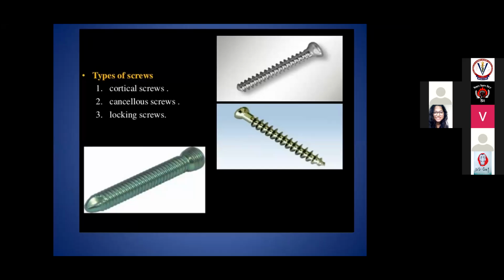Now coming to the bone plating procedure. Bone plating, compared to these intramedullary procedures, we have seen so many intramedullary procedures. Bone plating is a further advanced procedure compared to these pinning procedures because it provides very rigid stability at the fracture site, and we are fixing a plate to the bone with the help of screws. So naturally it provides better fixation compared to simple intramedullary pinning.